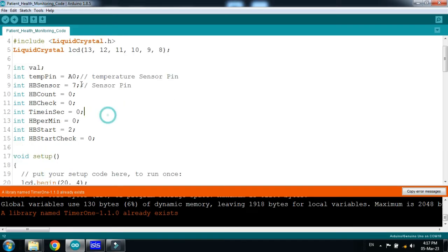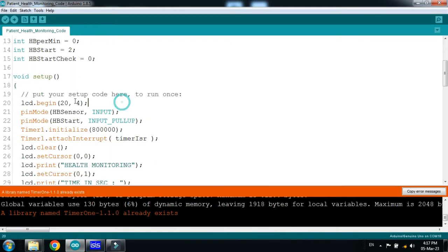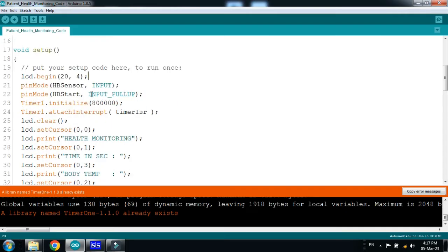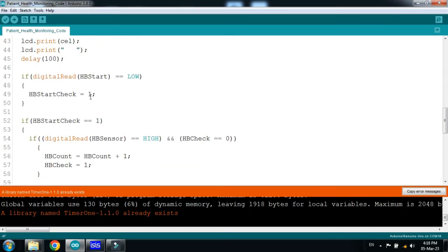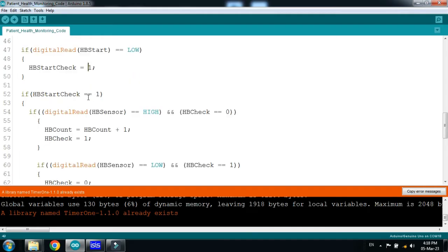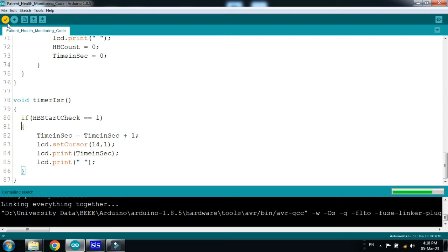Pin 7 is connected with the heartbeat sensor, and pin 2 is connected with the push button. We are using a 20x4 LCD. You can see the declared input and output pins. It will measure the body temperature, and when the button is pressed it will check the heartbeat and count the seconds using a timer. Now click Verify and run it.